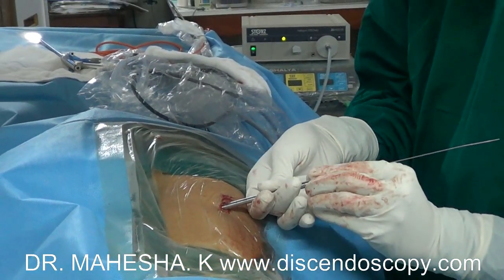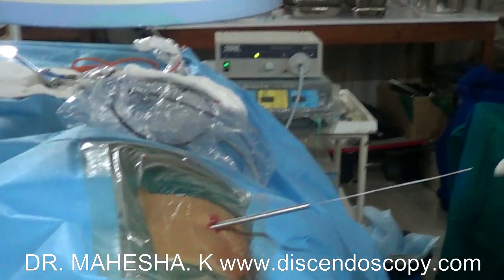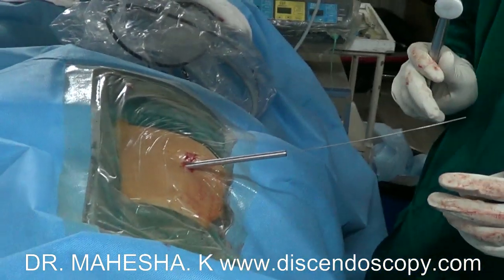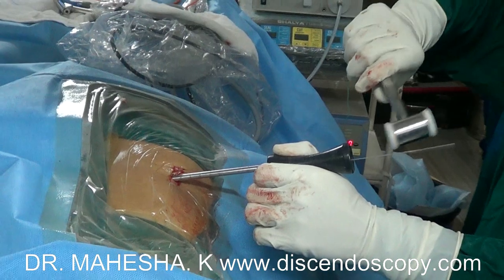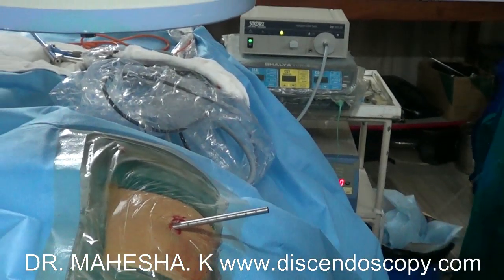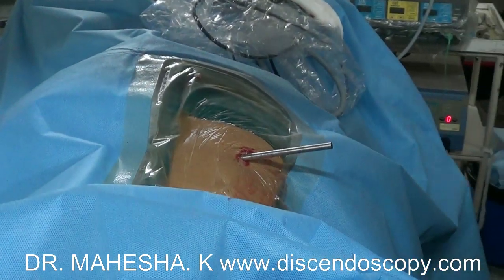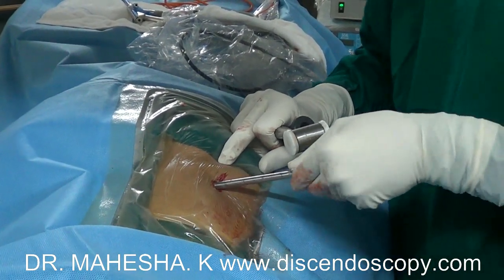The angle of entry is about 20 degrees. Once the dilator reaches the annulus, we gently tap the dilator into the disc space. Once the dilator is in the center of the disc space, we insert a cannula over the dilator into the disc space.